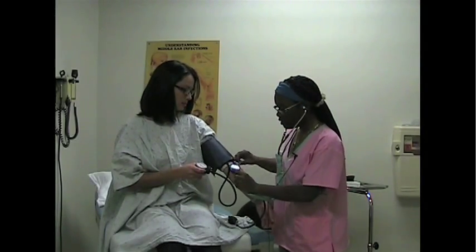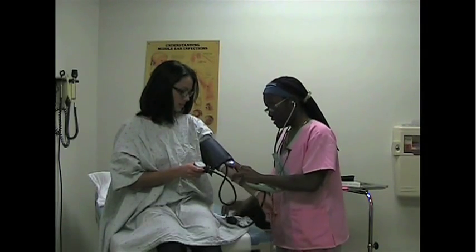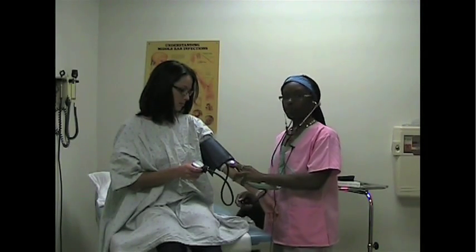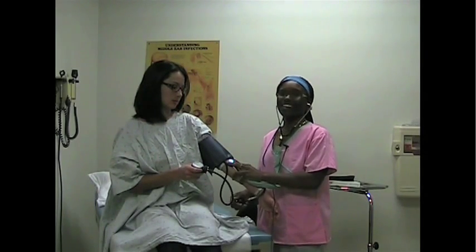You place the stethoscope on the artery and you listen for the two pressure points, which would be diastolic and systolic.